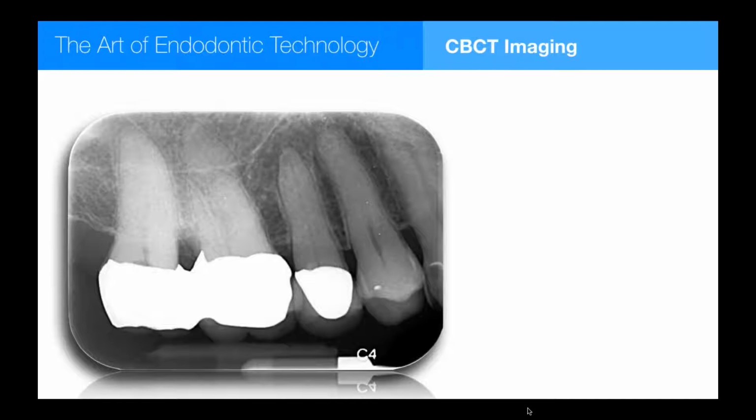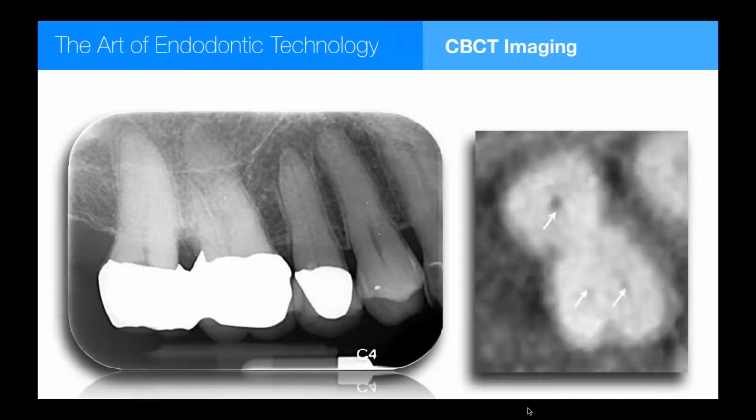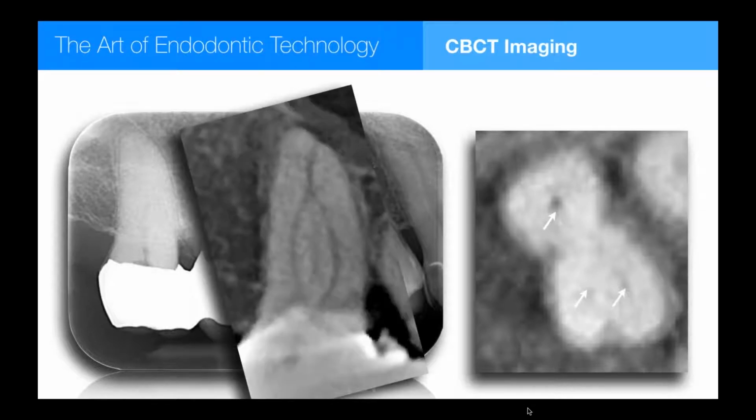The second molar became irreversibly inflamed. I can't see anything about the anatomy. I see a block of root, maybe a pulp chamber. I can't tell if this has 1 or 5 canals. So I decided I need help on figuring this out before I get inside there. Turns out it is a fused root. There's only 3 canals. And then I look at it from the buccal, making sure the slice is exactly through the canals in the buccal root form.